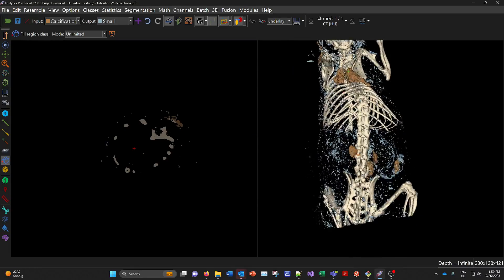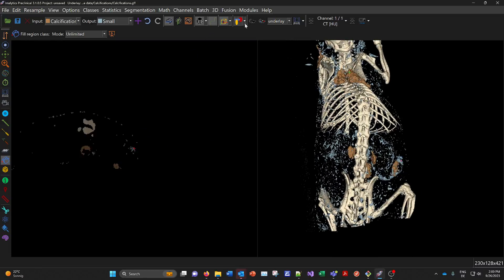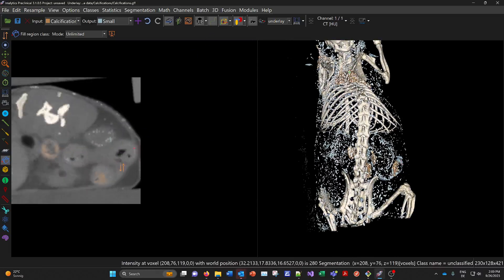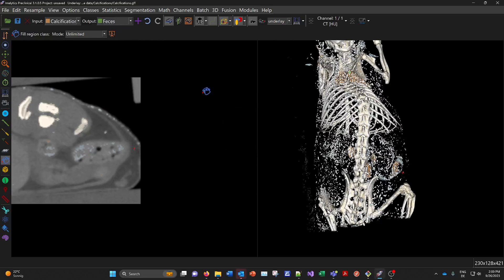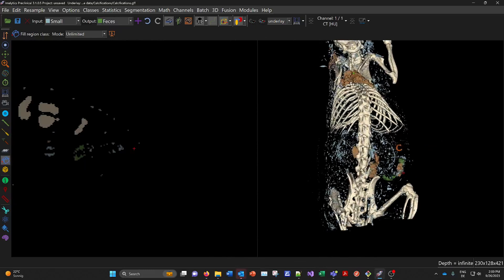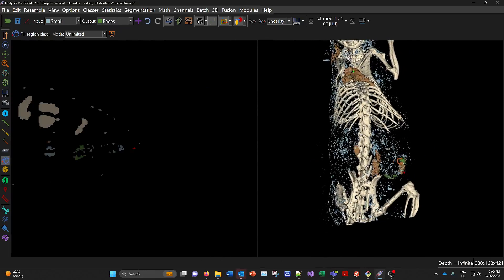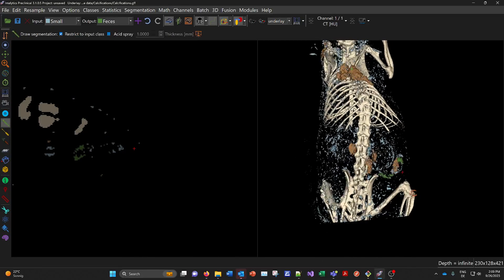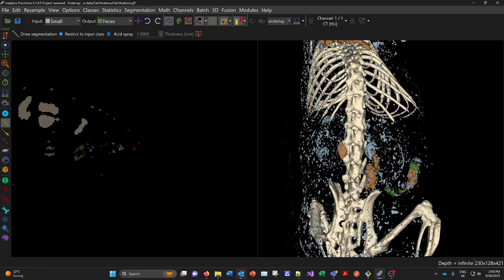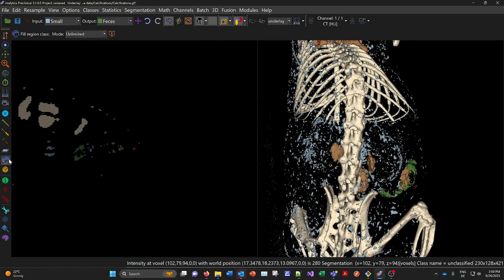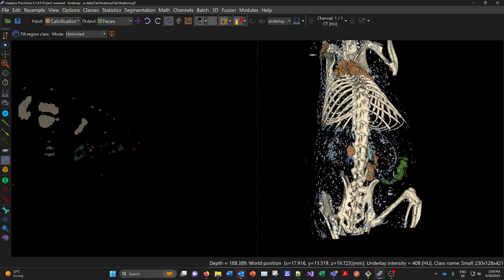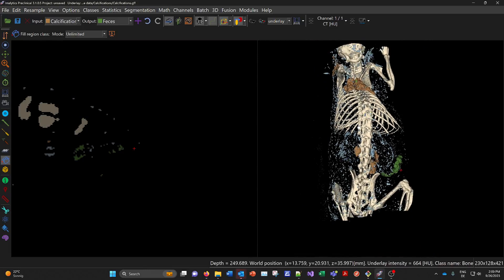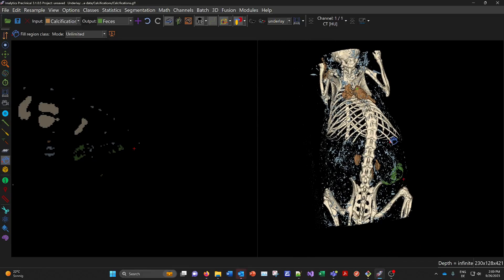And now I see here there's also some stuff here. This is not calcifications. This is the feces here. So this is in the gut. Some guys. So you might want to get rid of these. We call this feces and kind of pick those out here in 3D or use the interact. This tool here to get them a bit more efficiently. Like this. Because they are not calcifications. It's more from the feces. So maybe it's a good idea to use a special food which doesn't have, I think it's bone chips in the mouse food.